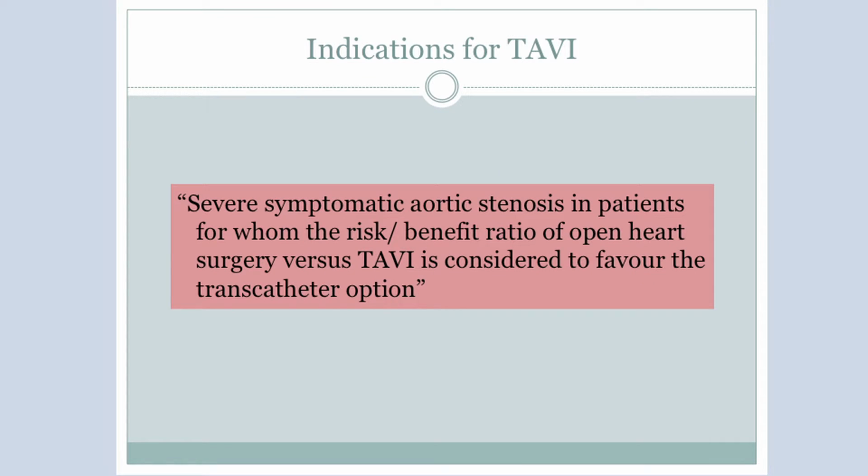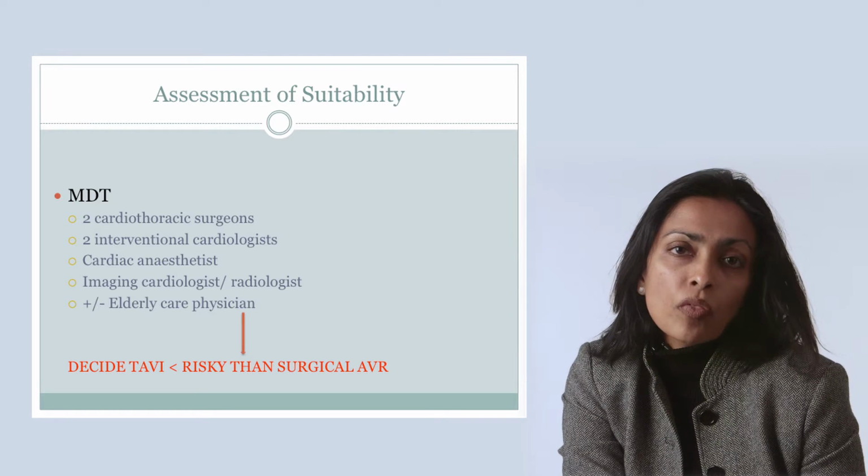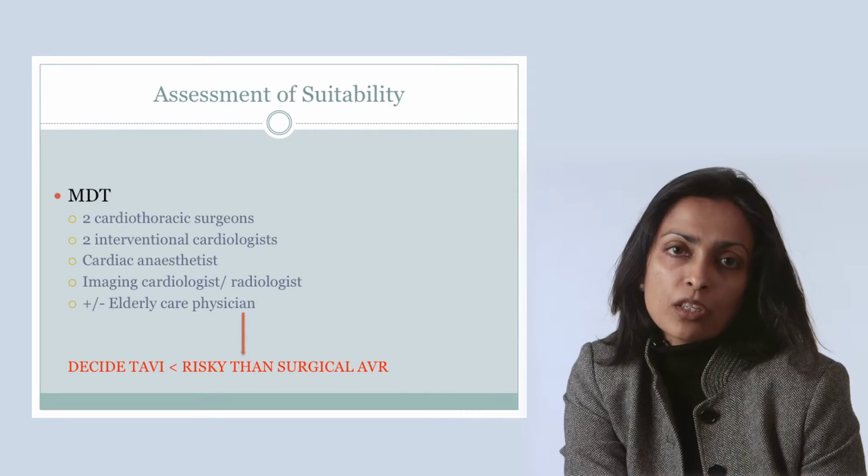So, the current indications for TAVI are severe symptomatic aortic stenosis in patients for whom the risk-benefit ratio of open heart surgery versus TAVI is considered to favour the transcatheter option. Assessment of patient suitability hinges on the multidisciplinary team discussion.